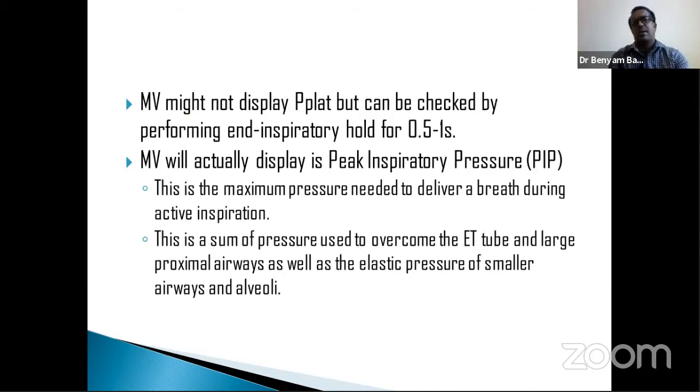But other than the plateau pressure, almost all mechanical ventilators will display the peak inspiratory pressure, either in graphs or in numbers. So it will indirectly tell you what's going on with the plateau pressure.